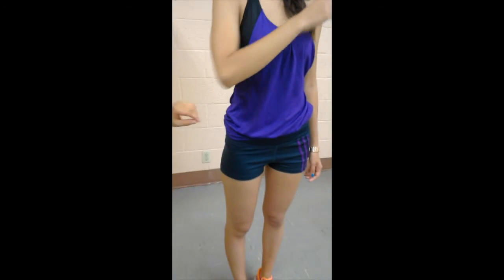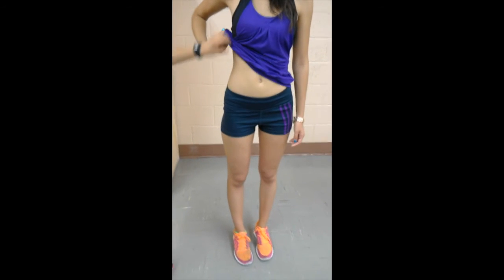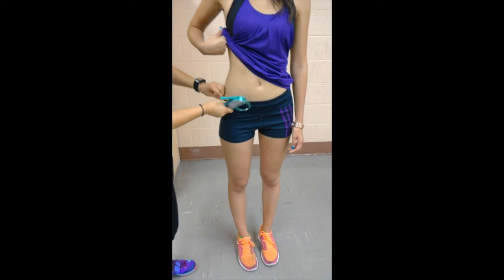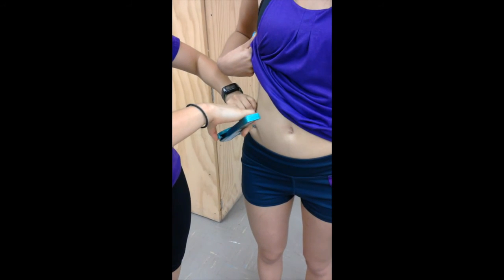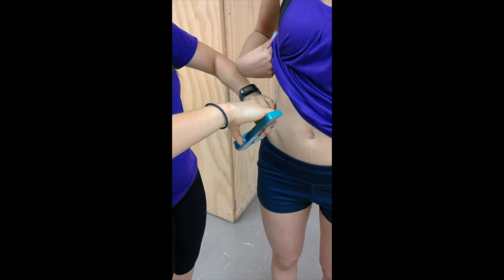Next, we have the suprailiac site, which will be measured in line with the iliac crest, taken in the anterior axillary line immediately superior to the iliac crest. This measurement will be at a diagonal fold.